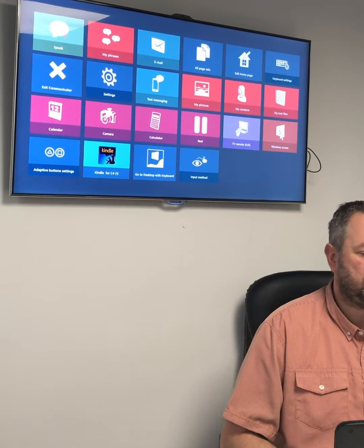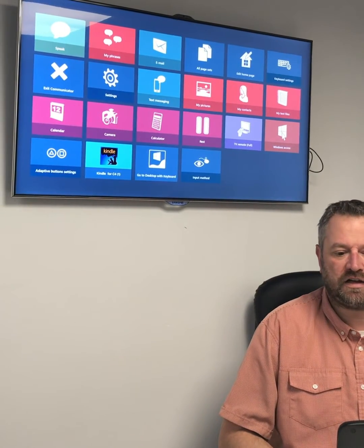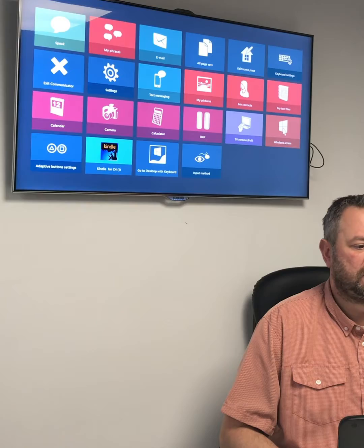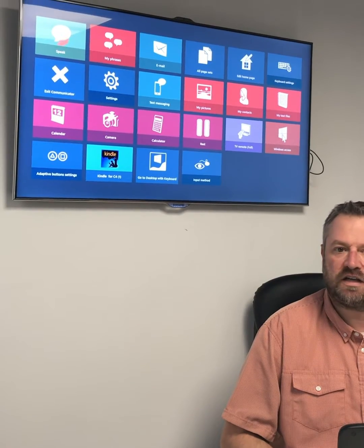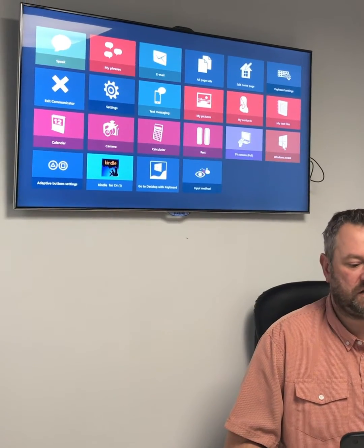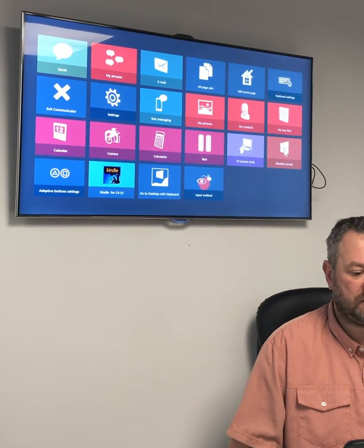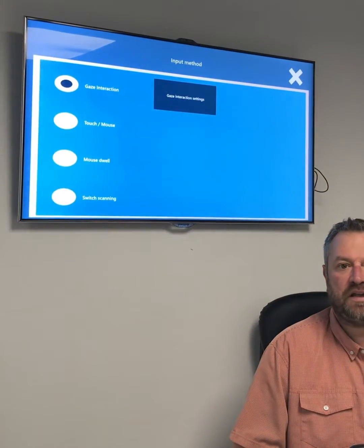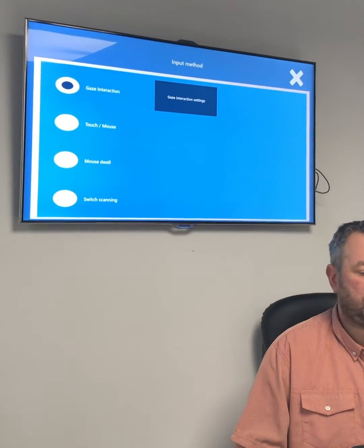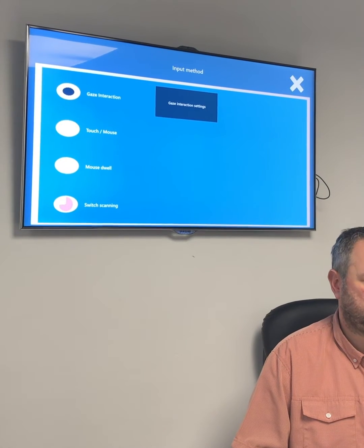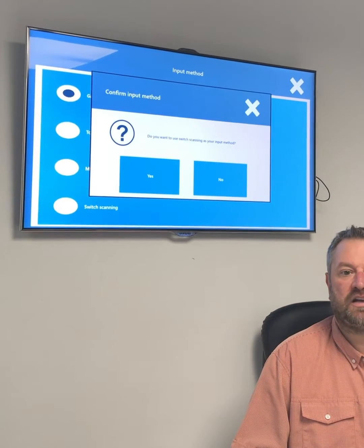At the moment you can see I'm using eye tracking to look around and select things on my screen, but if I go into input method now, I can change to switch scanning.